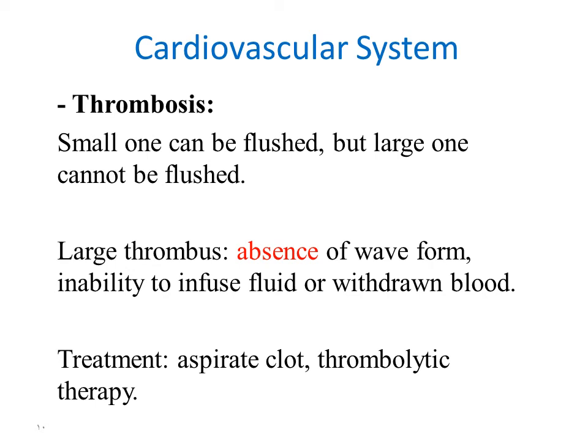Thrombosis: a small one can be flushed, but a large one should not be flushed. A large thrombus may lead to the absence of the waveform on the monitor, and inability to infuse the fluid or to withdraw blood. Treatment: aspirate the clot. In severe conditions, thrombolytic therapy could be used.